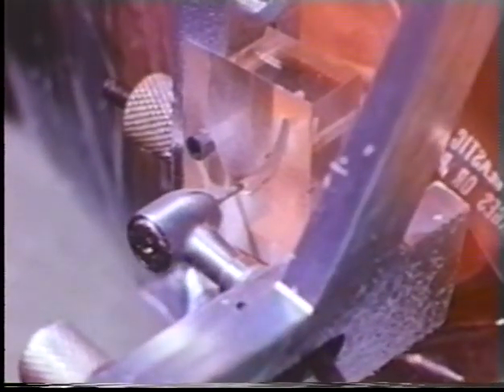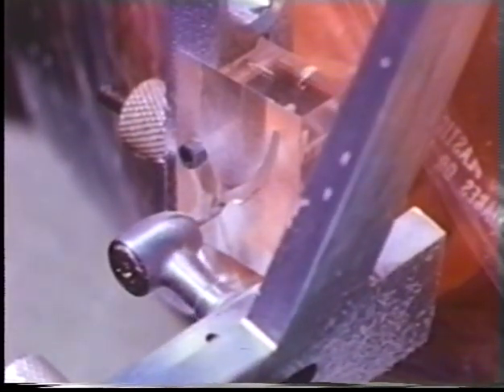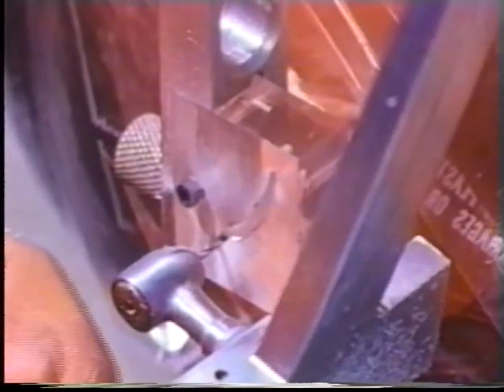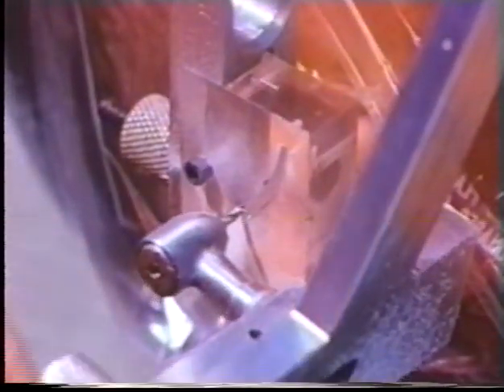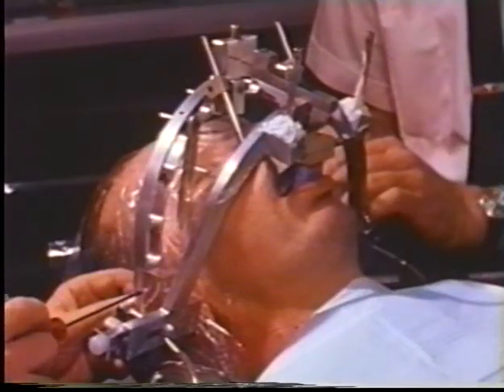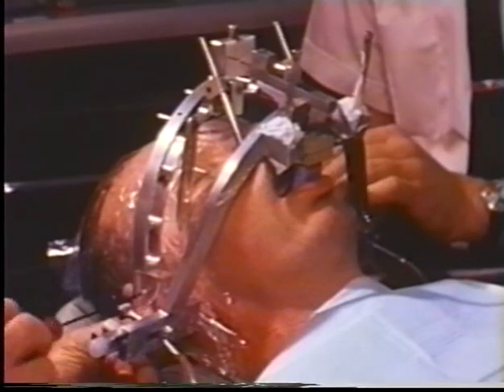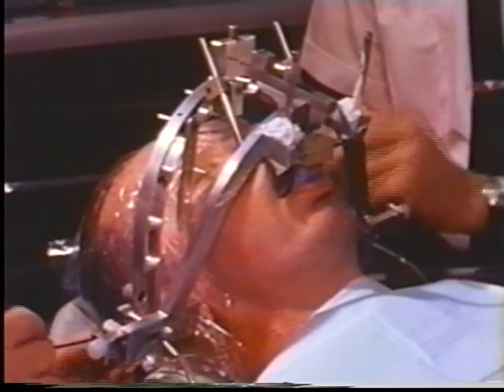The right lateral movement is now recorded and appears on the working side as a backlash. The mandible is returned to centric relation with the drills inactive. The axis record blocks are switched from right to left so that the blank sides may be used for recording the protrusive movement.